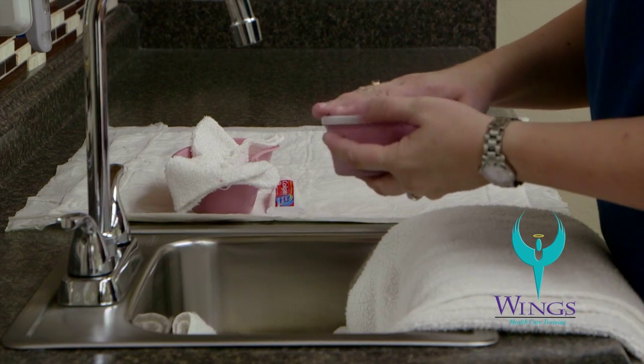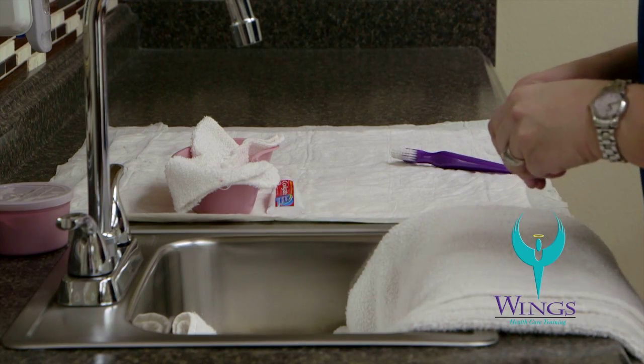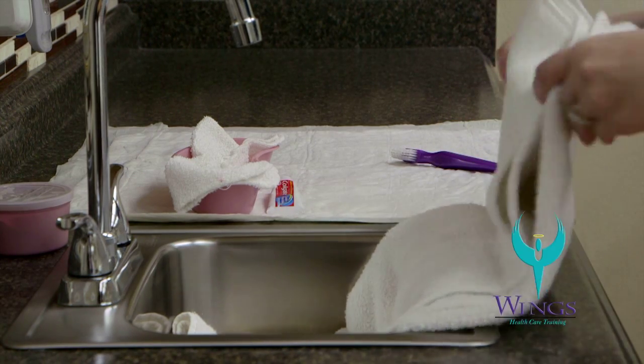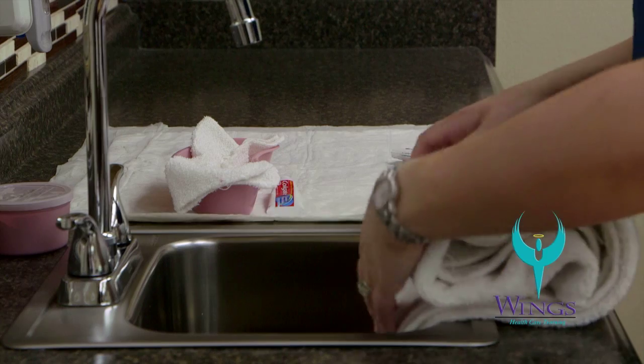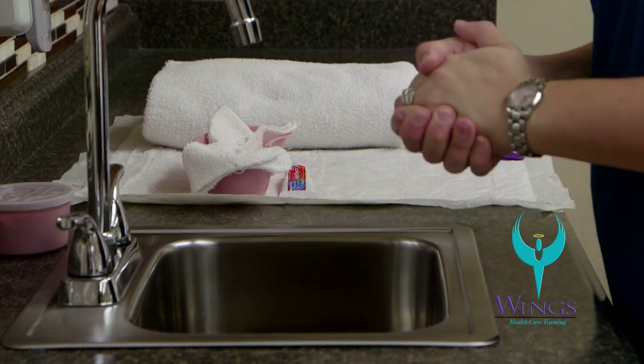Turn the water off, put the lid on the denture cup, and place the cup at the back edge of the sink. Clean up your supplies with the dirty linens going into the trash. Remove your gloves and wash your hands.